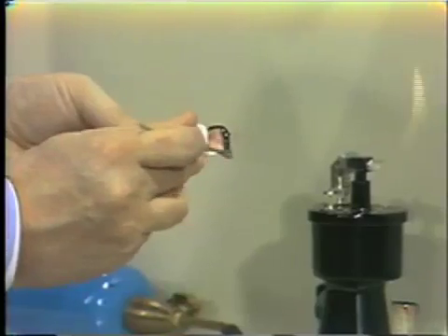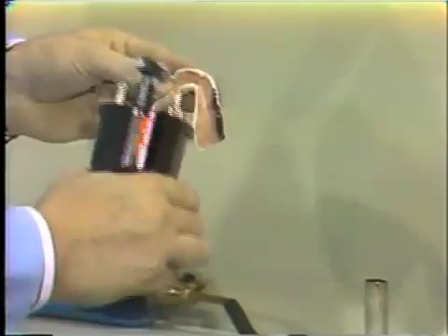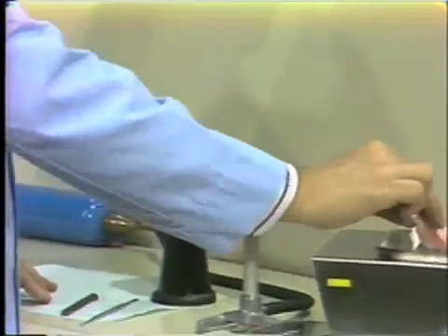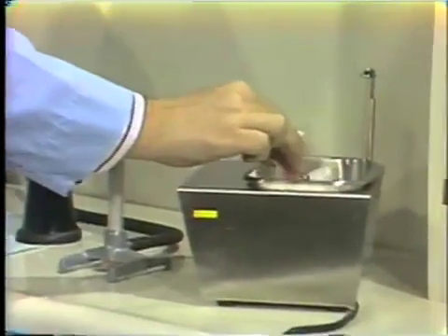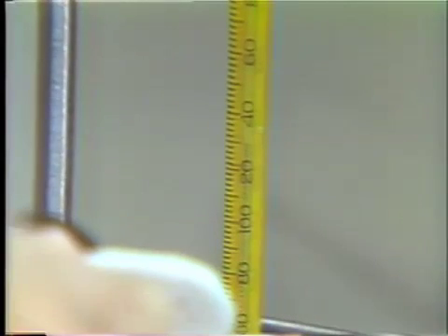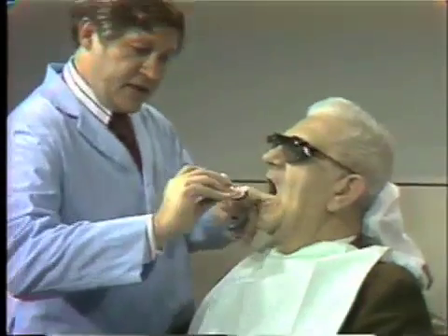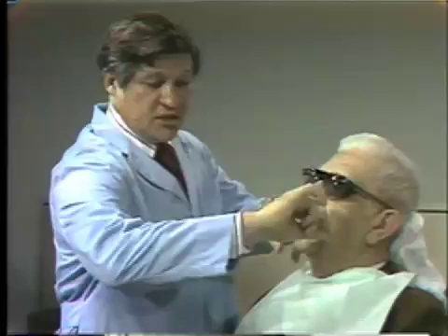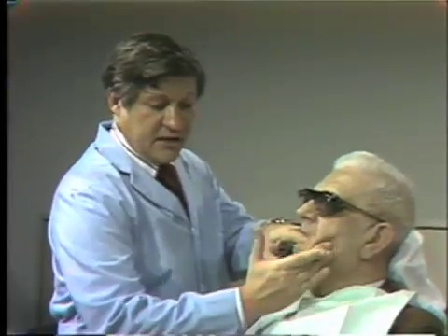Once you have made your initial compound extension, flame it very carefully with the alcohol torch to make sure the compound surface is molten, and then before you go back to the patient, always temper the compound in the water bath. The water bath temperature is at approximately 130 degrees — between 100 and 135 degrees is adequate for tempering the compound. If the water is hotter than that, it would of course burn the patient. Then ask the patient to open, carefully insert the tray over the residual ridge seating it properly, and taking hold of the cheek, roll the cheek out, down, forward, and massage it gently — in this way you extend the buccal flange in a process we call border molding.